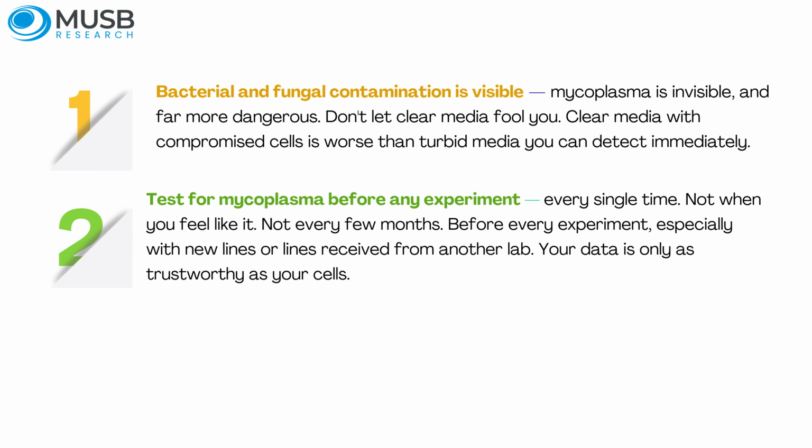2. Test for mycoplasma before any experiment, every single time. Not when you feel like it. Not every few months. Before every experiment, especially with new lines or lines received from another lab. Your data is only as trustworthy as your cells.